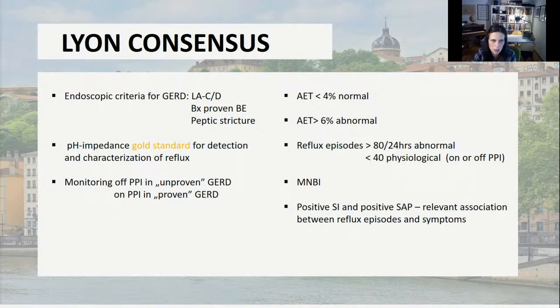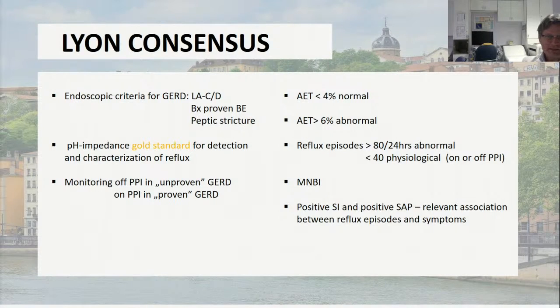Čemu se vi konkretno, profesor Jurčić, kad dobijete takav nalaz, recimo da je 5, je li tu prevagne klinička slika ili prevagne anamneza? Klinički njuh, ja bih rekao, pazi. Sve te smjernice i to je sve jako lijepo, ali treba na konkretnom slučaju to sve odvagnuti.